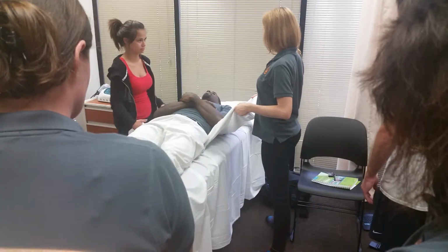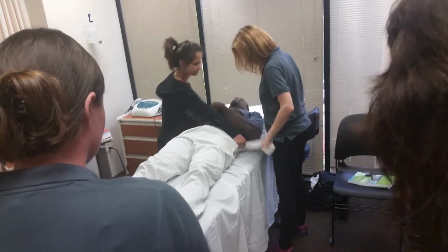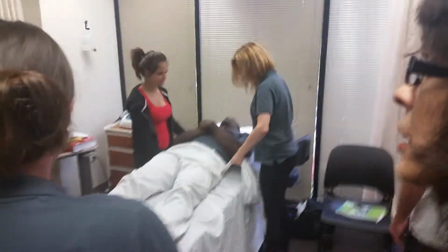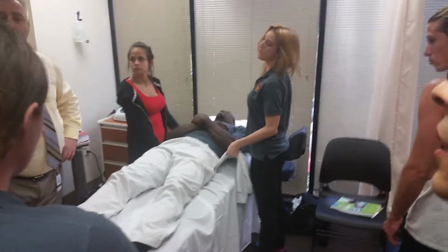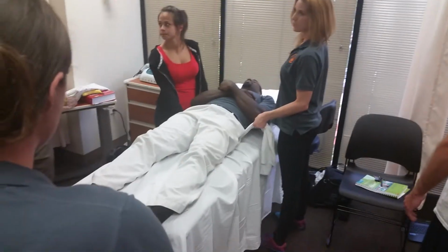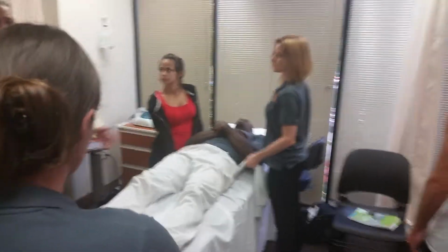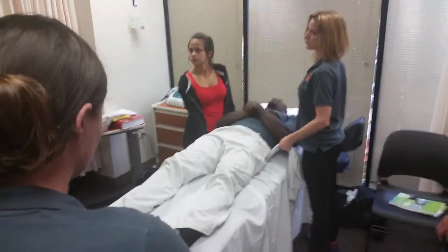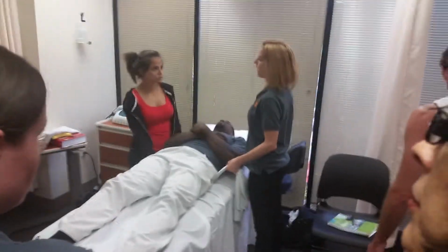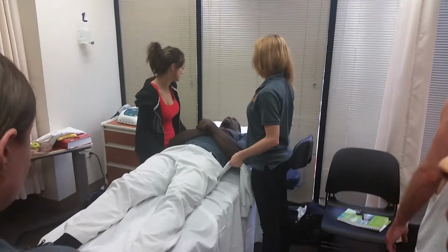That would be easier if you hold closer. Hold the sheet closer to the body. You want to be as close as you can. At the same time, I don't want anybody to get hurt. Mike used to work construction, and he could tell you moving boxes and equipment is a lot different than moving live people with segments and arms. It's totally different. So you don't want to get hurt, but you'll learn from your mistakes as well. All right?